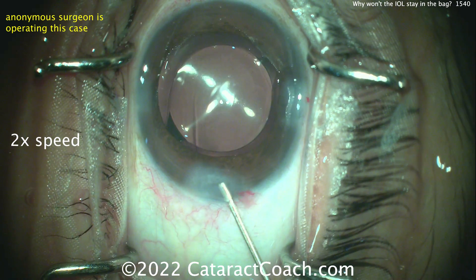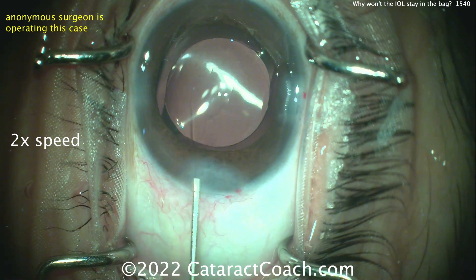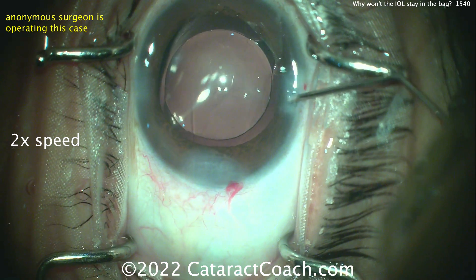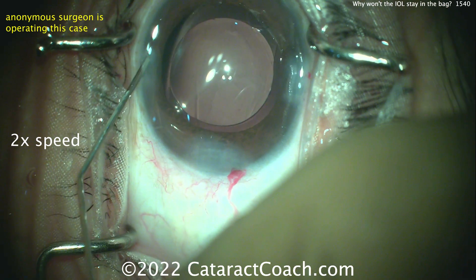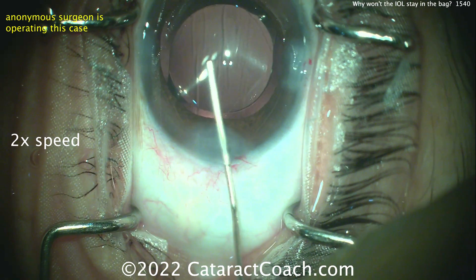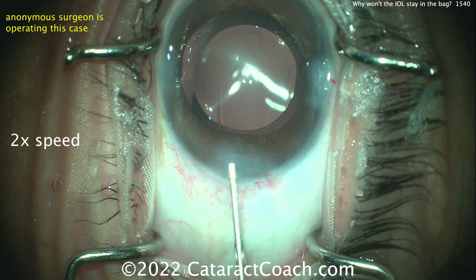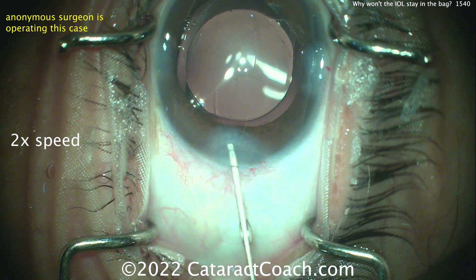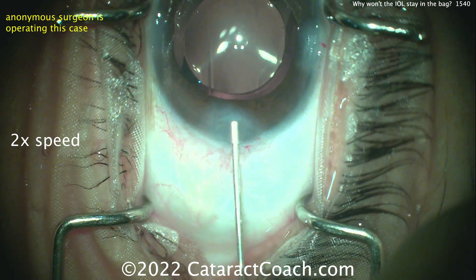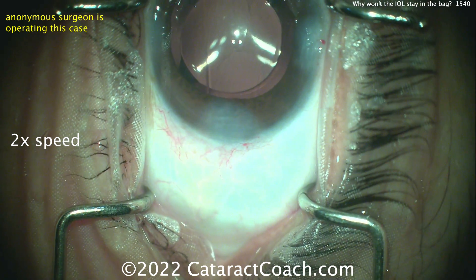Loosening the speculum even more — keep that in mind. If you get that speculum in the eye and really crank it, you can cause posterior pressure, which can affect you during the case. It may not be as evident during the case because you have the phaco probe in the eye with high infusion pressure. But at the end of the case, when you're just trying to get things balanced, incisions sealed, the eye inflated, and the lens in the bag, you may notice more of an issue. Loosen up that speculum at the end. Once you seal the main incision, avoid using it — leave it alone. If you need to do any adjustments, go through the paracentesis, and you'll be able to get that lens in the bag as it should be. Leave the eye a little firm towards the end of the case, and you'll have a really nice outcome.